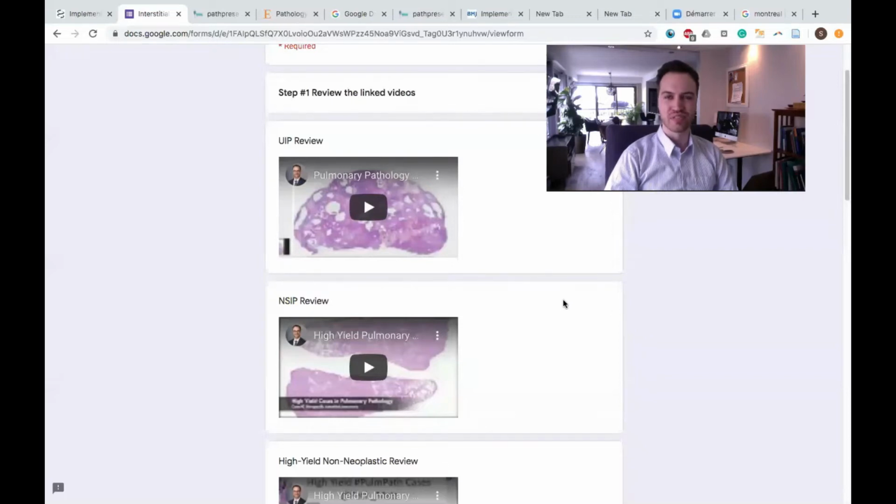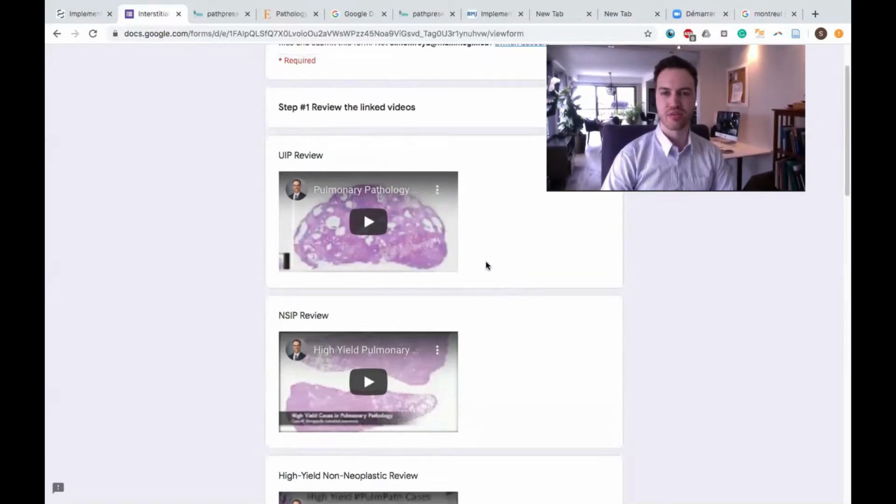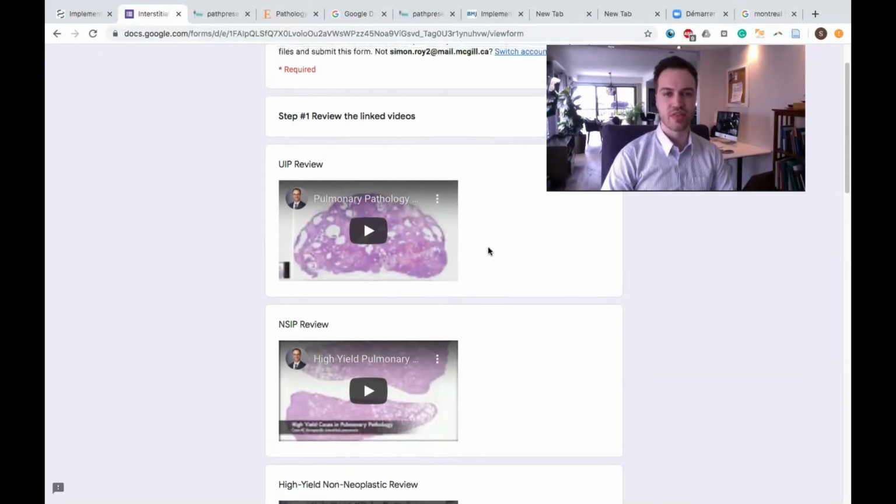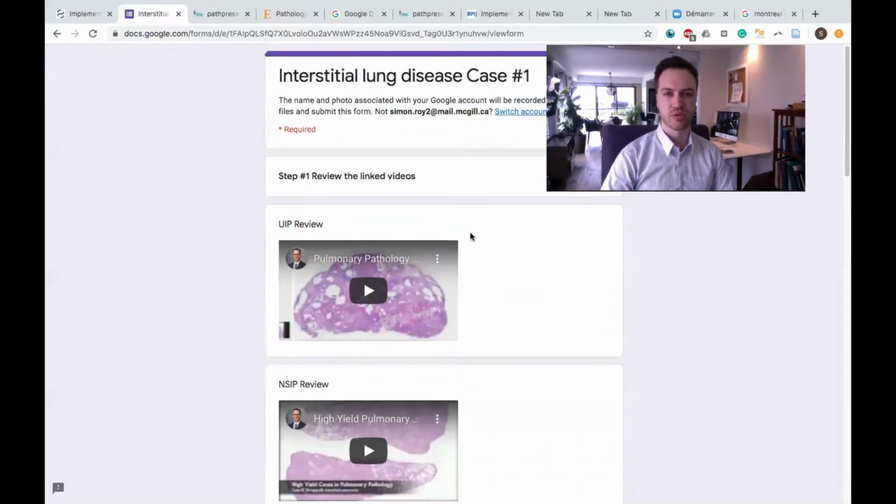I'm a resident from the University of Montreal. I want to show you a teaching method that Dr. Matthew Cecchini and I have been doing during my month of elective in thoracic pathology. Because of the COVID crisis, case volume is down in surgical pathology, so this method allows a supplement to the regular caseload in order to also reinforce learning concepts.